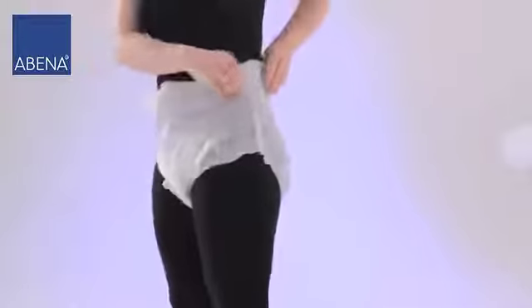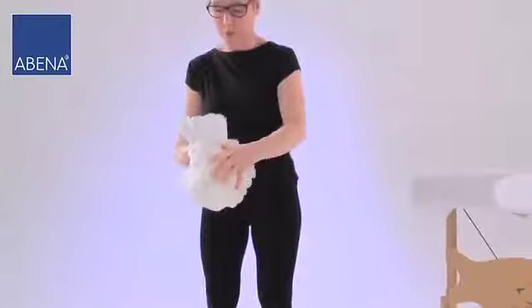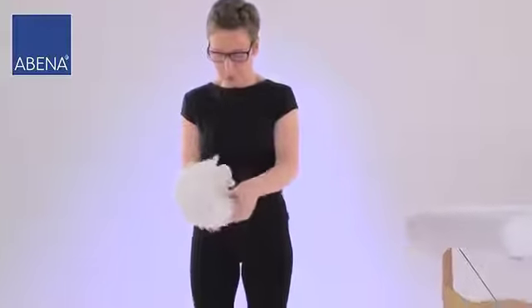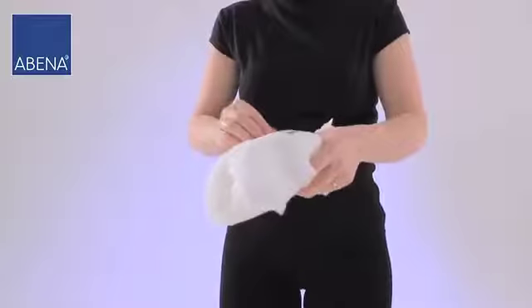When the product needs to be changed, side seams can be torn off. The product can be easily removed as it opens on both sides. Then pass the pants between the legs from the front to the back. The pants can be rolled up and thrown away.